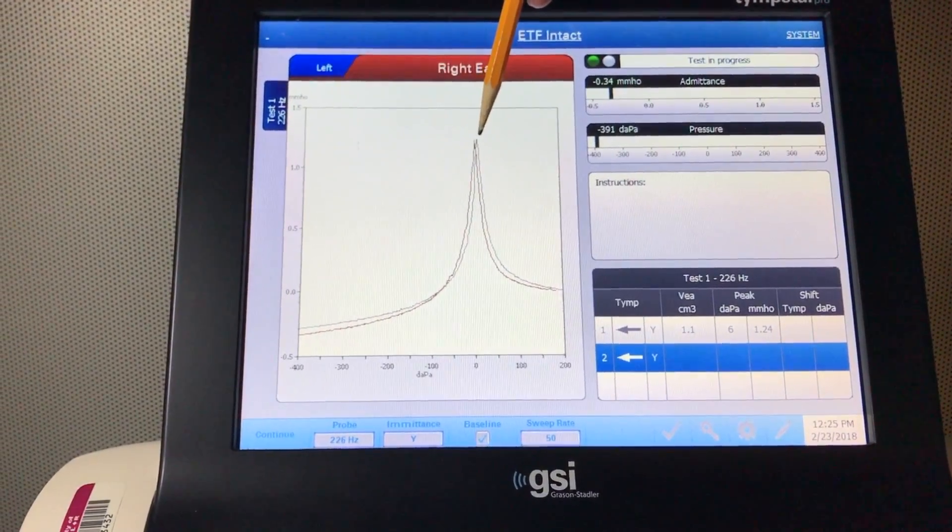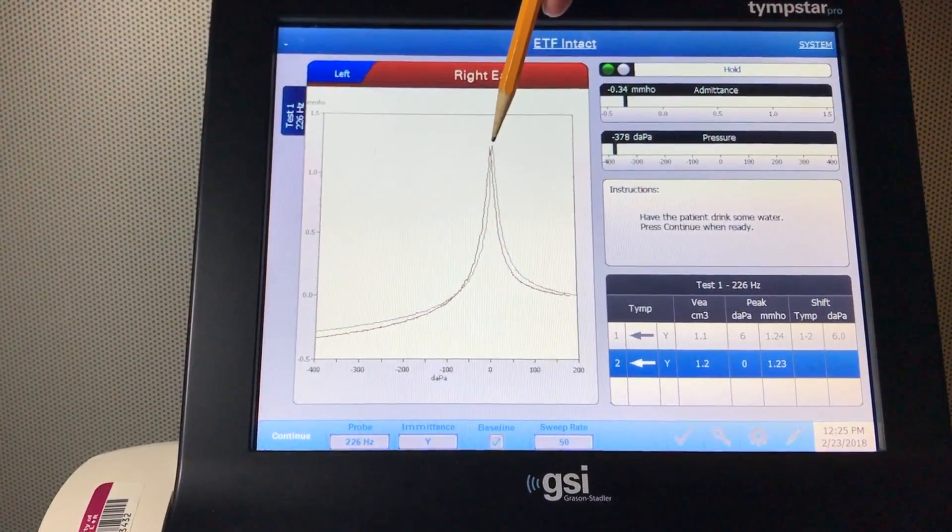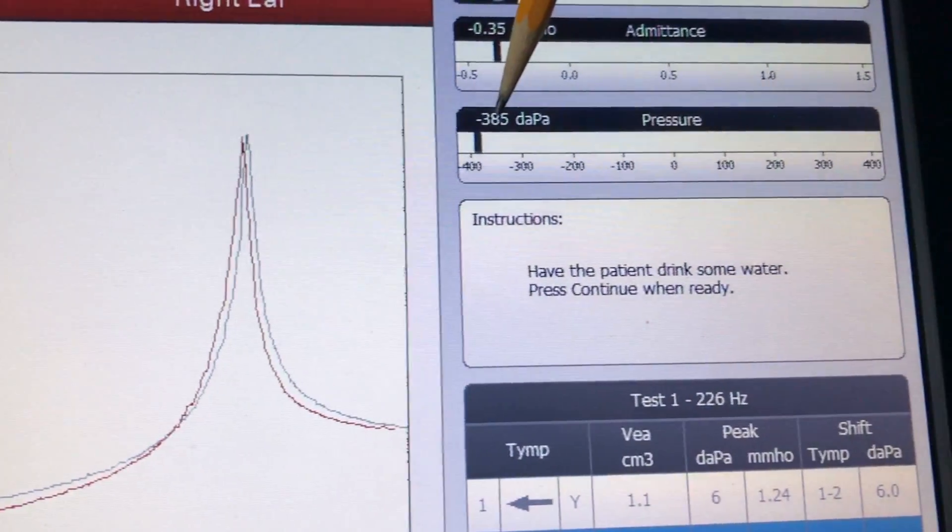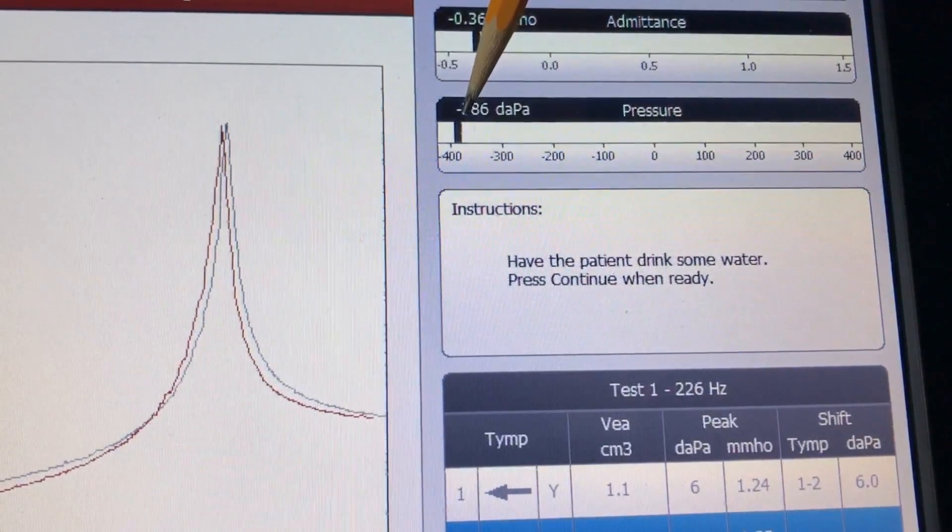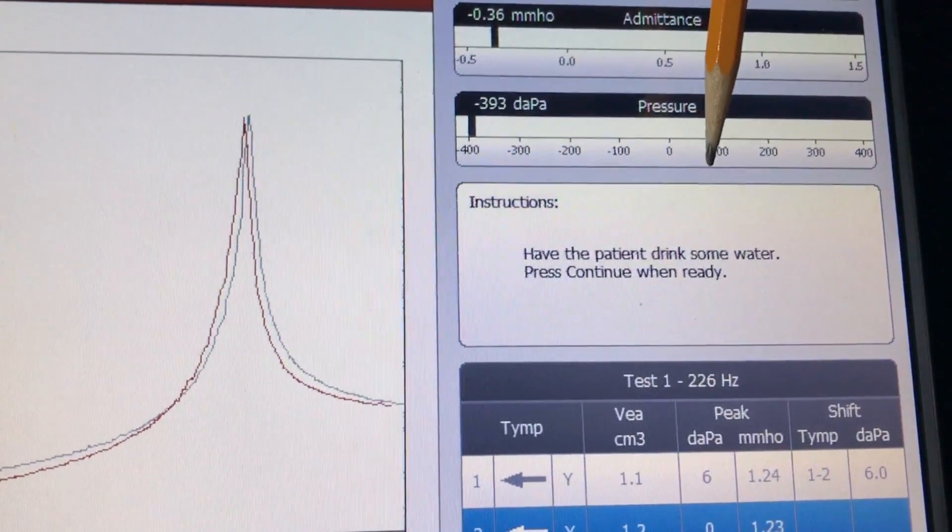As you can see here, the peak is now shifted to the negative side, and now the instrument creates a negative middle ear pressure which is minus 400 decapascal. Once the pressure is maintained in the ear canal, have the patient drink some water.